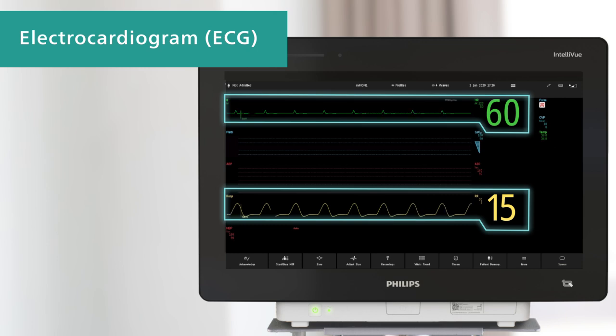For the respiration measurement, the monitor measures the thoracic impedance between two ECG electrodes on the patient's chest.